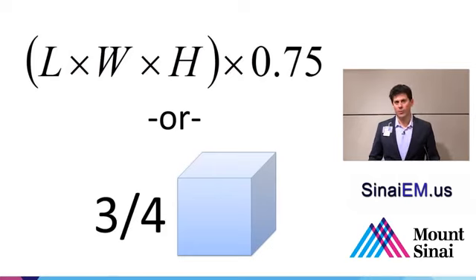So again, a couple ways you can use this. You can make sure that you're not doing dry taps, and that's very helpful. You can assess a person for having a large bladder or small bladder in the setting of difficulty in passing urine, and you can also use it to do a non-invasive post-void residual. So instead of having the patient urinate and then catheterizing them and measuring the output, you can have the patient urinate and then measure their bladder volume.